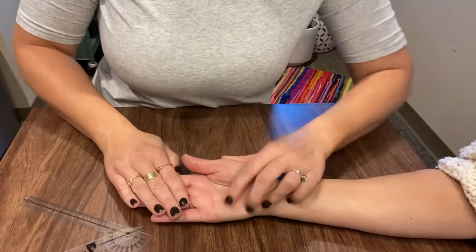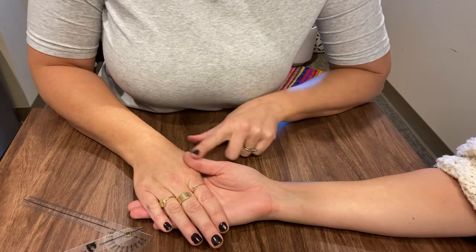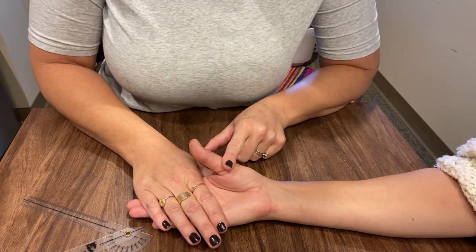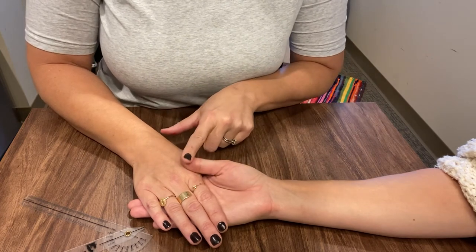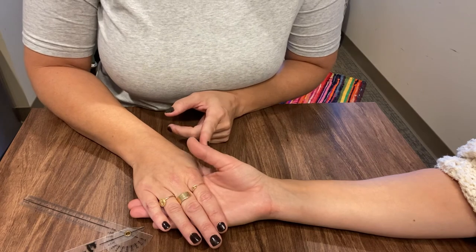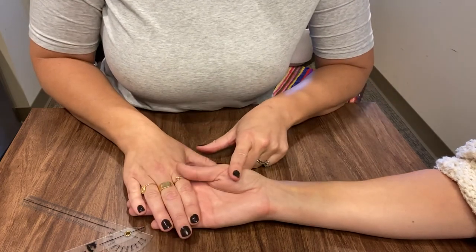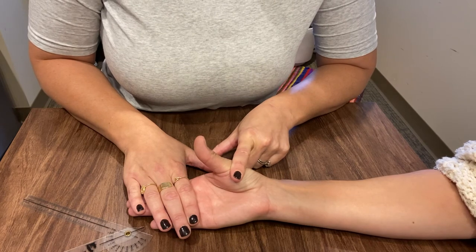You're going to have her supinated and bring her up. Ask her to bring her thumb away from her palm, get her to show you the motion, then come up a little bit and hold. I'm not placing the goniometer out at the IP or MCP — I'm right here in the meat of the thenar eminence, and I'm asking her to come up and hold. And that's it.